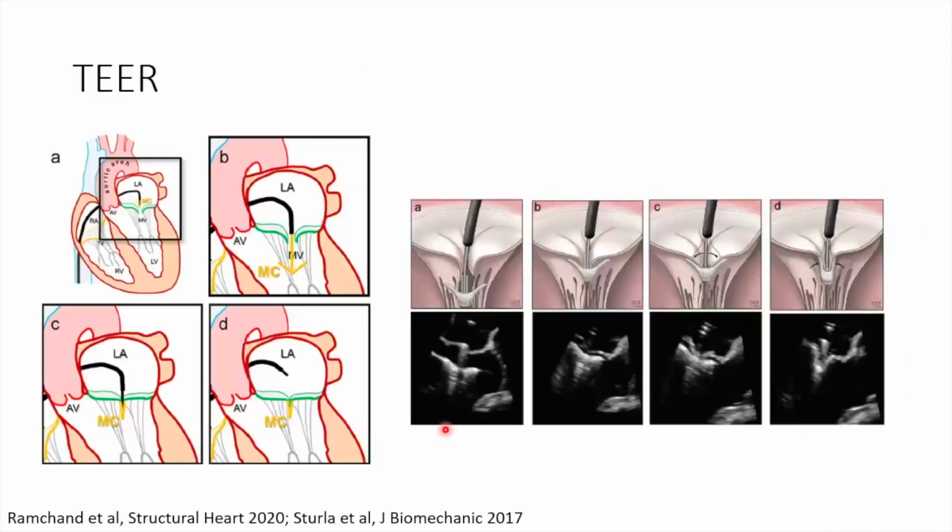So how does this actually happen in the procedure? I thought these were actually nice, simplified graphic assessments of what happens during the procedure. And I come back to this not because I'm not focused on intraprocedural guidance, but more so to understand how these elements during the procedure really affect the post-procedure outcomes.